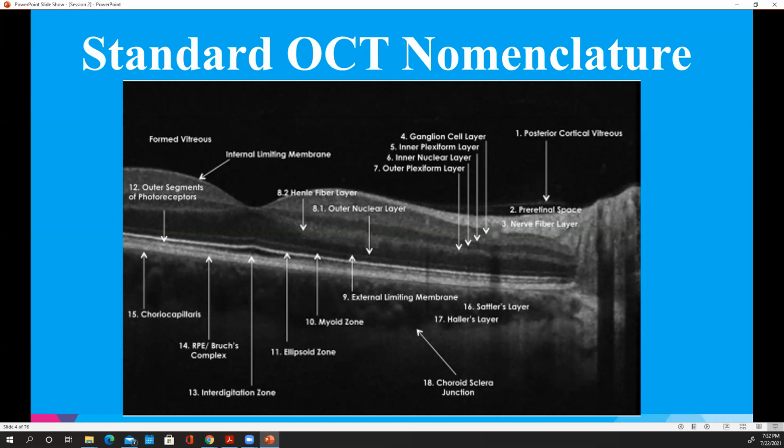So this is actually the whole purpose of doing this, is so that most of this you're going to be able to say. It's super intimidating, at least I felt that way when I first looked at it. For all the retinal findings here, it's sort of like, oh my gosh, how am I going to memorize that? My whole strategy is to basically over-educate you such that this becomes not a big deal. That's the whole reason for teaching you retinal circuitry, and that's where the brainchild came from. So that you could say, wait a minute, of course, that is the ganglion cell layer or what have you, okay? That's the goal at the end of all of these, that we go through it and you can actually list most of these without having to look at it.